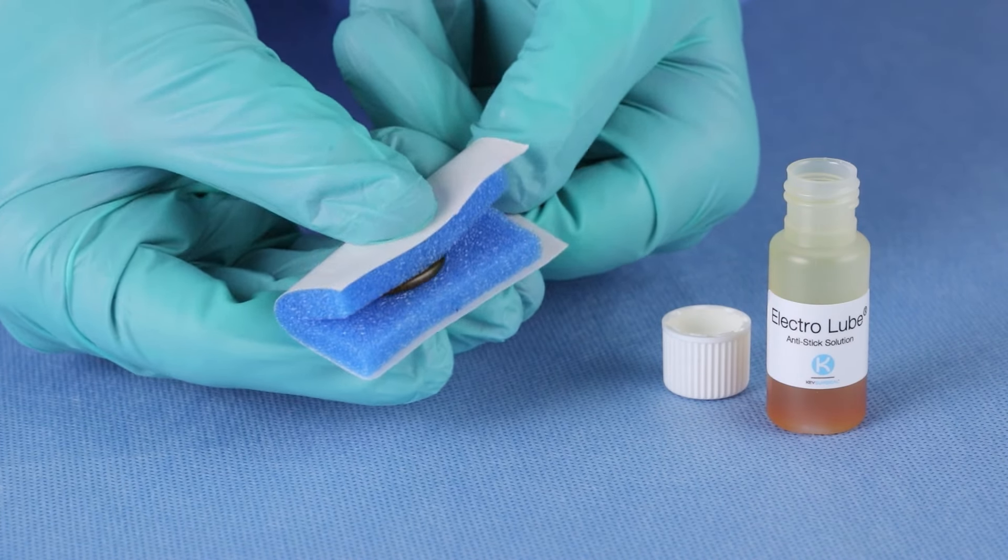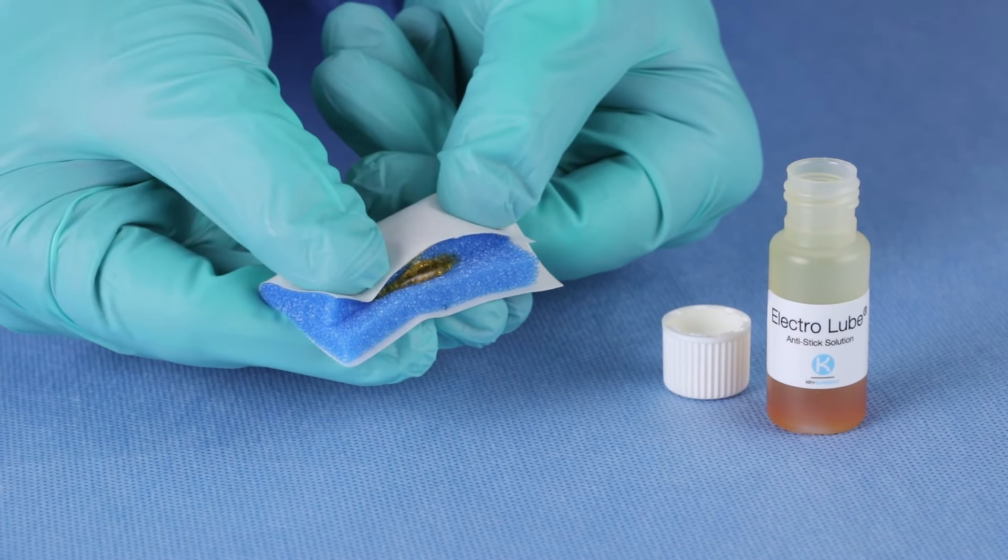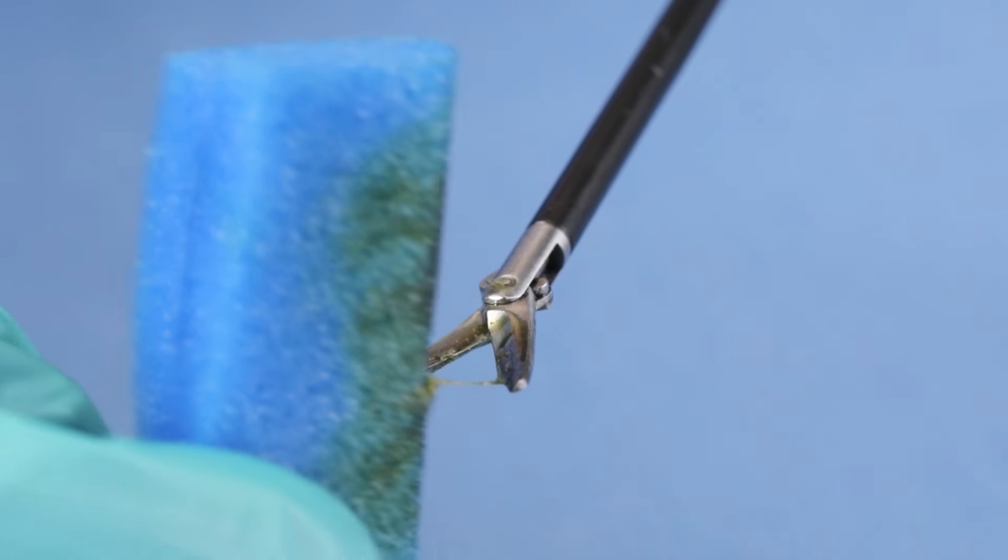To coat a jointed instrument, fold the pad, allowing the Electrolube to absorb, then grasp the fold with the instrument.